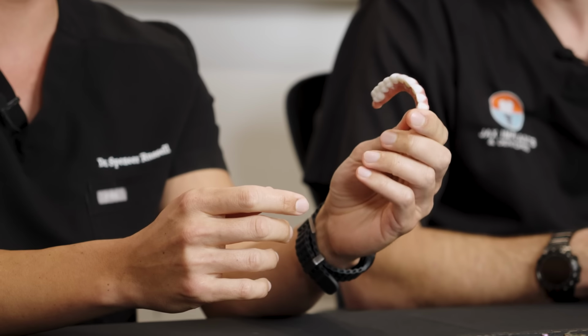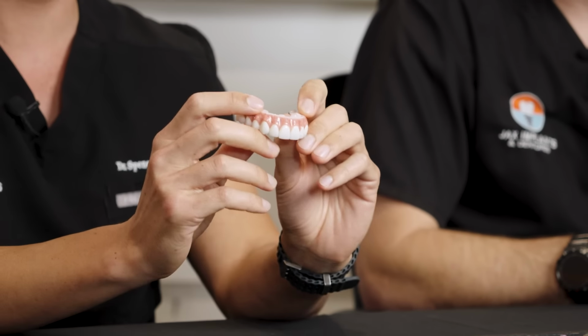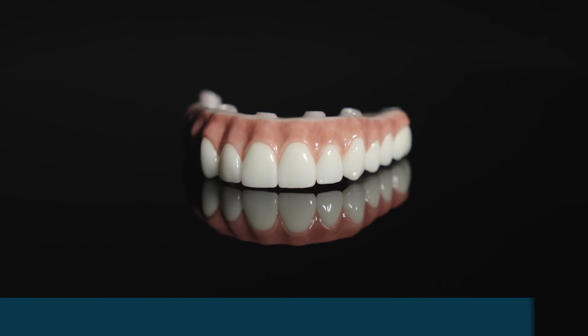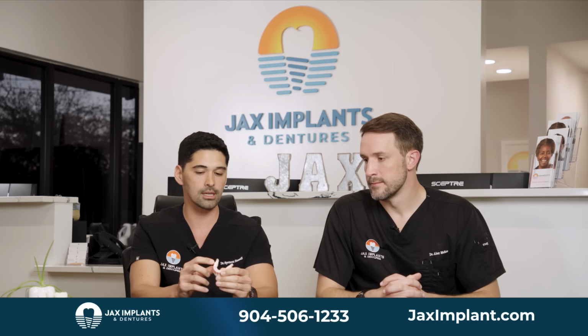Really what I break down for our patients is that the best thing about the monolithic zirconia is that it is incredibly hard and incredibly smooth. And just like Dr. McRee was talking about earlier, with this more porous temporary material trapping stuff and staining, zirconia is the most resistant option we have to that. And so it's not going to stain over time. The color, the shade that this goes in at, is going to be the exact same 5-10 years down the road. The other nice thing is this underside.